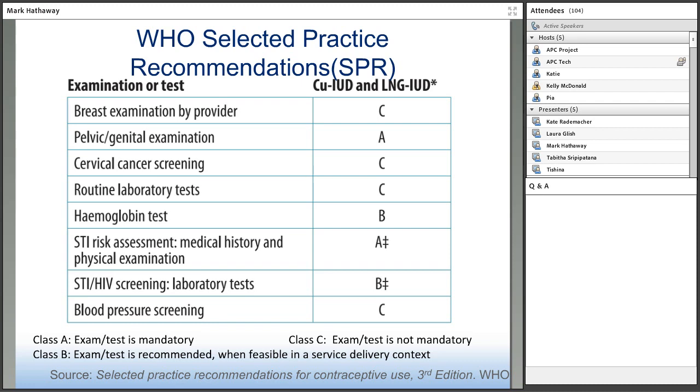A good look at the cervix, in many cases, going over a medical history with a patient, you can discern whether an infection is present or where you may want to avoid inserting an IUD.